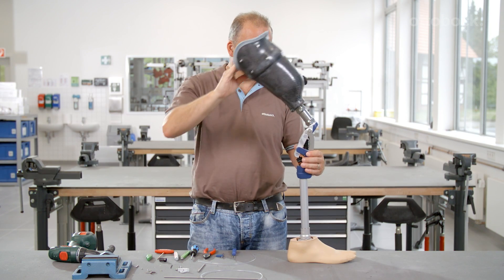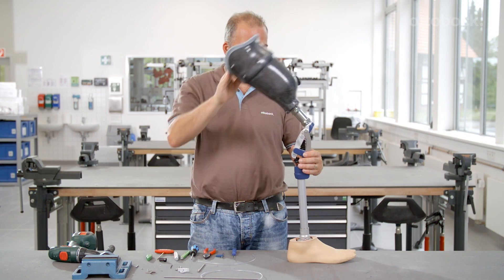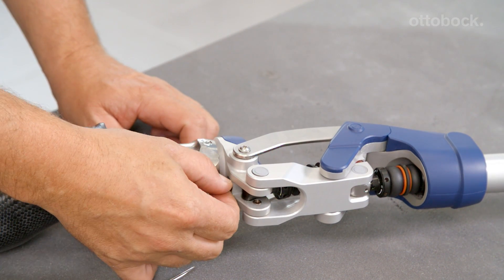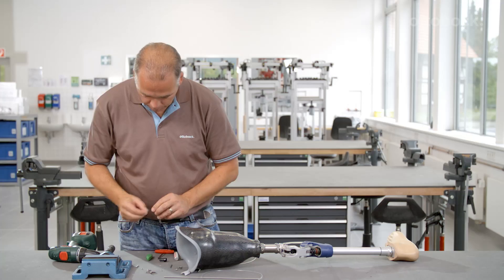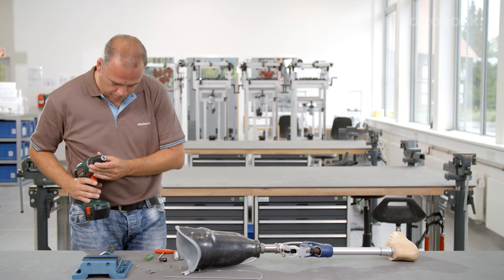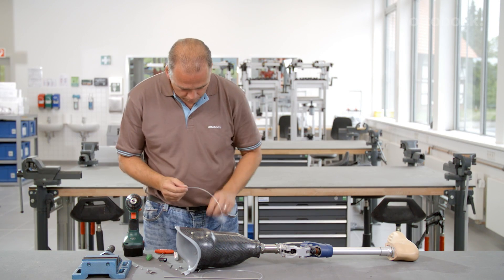Pheon is delivered with the lock deactivated, so the knee joint can be freely flexed. Please observe the following instructions for installing the lock release cable and activation of the lock. After installation, please check whether the lock release cable has been installed in accordance with all the instructions.